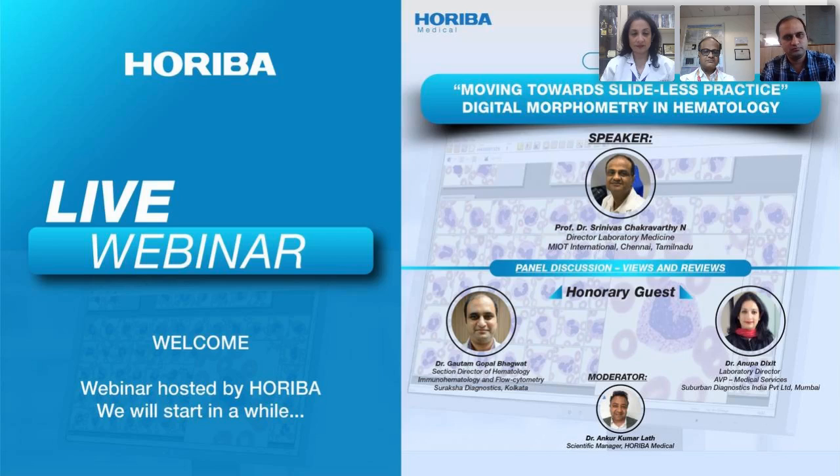Laboratory automation has been for long limited to clinical chemistry and immunochemistry platforms. Throughout the long history of laboratory hematology, the only reliable means for identifying, enumerating, and sizing blood cells has been optical microscopy of peripheral blood smears. And we all are aware that the practice carries many drawbacks, since it is inevitably time-consuming, is vulnerable to high inter- and intra-observer variability and imprecision, needs specific education and training in microscopy, and is poorly suited for rapid diagnosis. And of course, we all know that storage is also a problem too.